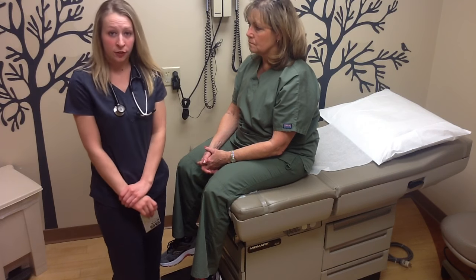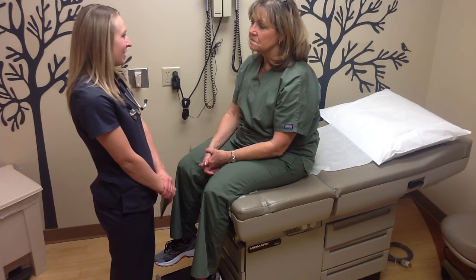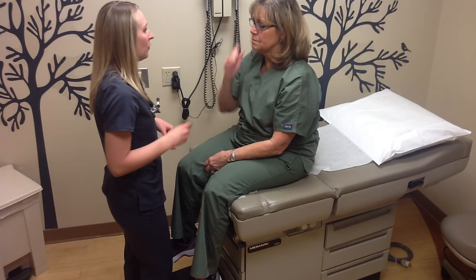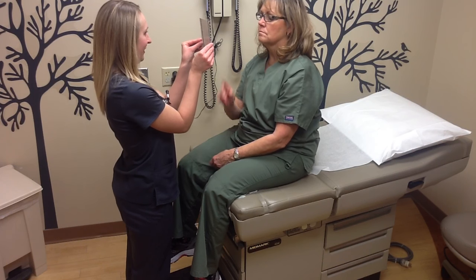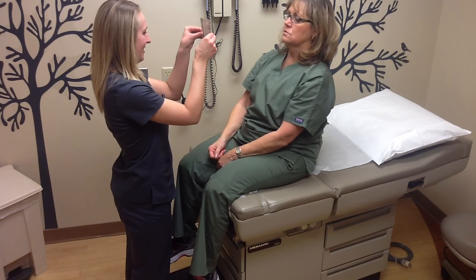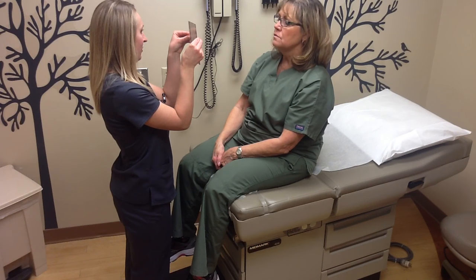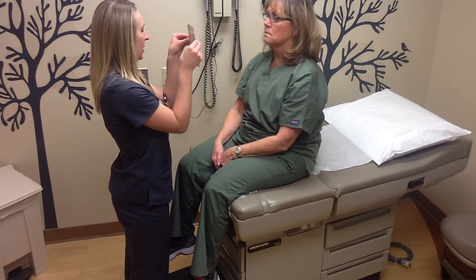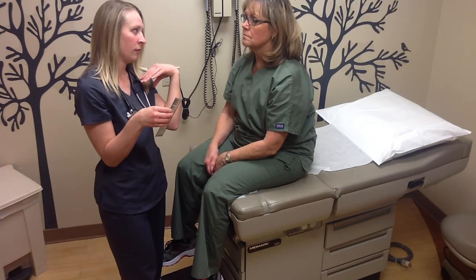Next I'm going to be doing a few vision tests on Sandy. So the first one we're going to do is the Snellen chart. So if you want to go ahead and put your glasses back on for me. Wonderful. If I can have you read that bottom line for me. Sorry, I'm nervous. It's too close. 428739. Good. And I would have had the patient cover her eye.